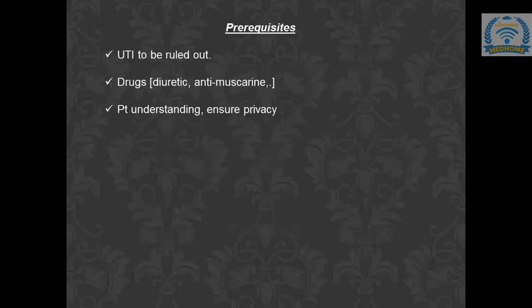Now, before doing urodynamics, we need to understand the prerequisites to perform urodynamics. First of all, from the patient, we need to ask about the history of urinary tract infection. We will be asking her about frequency, urgency, dysuria, or any lower abdominal pain.